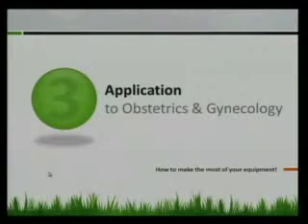And I want you to recognize that you can do a big hysterectomy with the cut mode and a pencil by just changing your tip, changing your dwell time, changing the tension on the tissue. You can perform that big surgery with a really simple instrument. And so that's kind of neat, you change all those variables and you can do something pretty complex with a pretty old technology. That being said, there are new technologies which make it easier and which should be explored. But let's talk a little bit about LEEP.